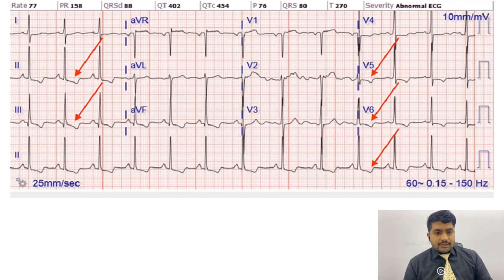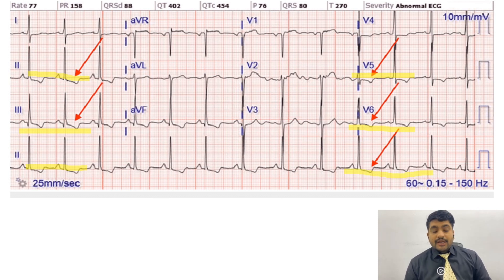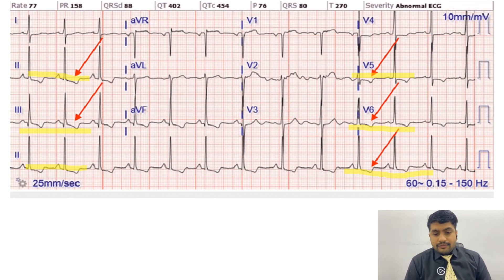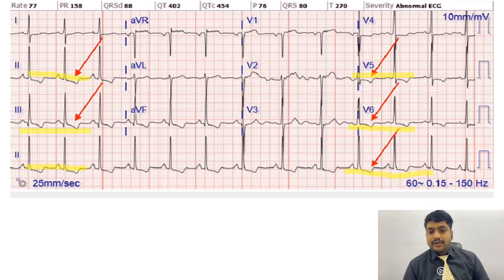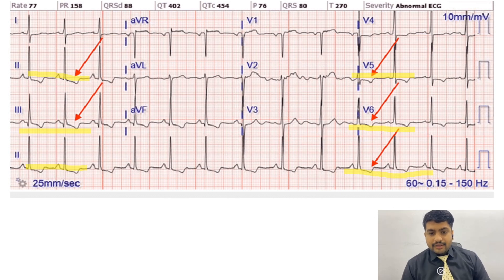In this ECG we have widespread T wave inversions across multiple leads. In the case of ST segment depression or T wave inversions, you should also look for a prominent R wave in that lead. If you go back and check all the ECGs just discussed, you will see that whenever there is ST segment depression, the R wave is more prominent than the S wave — meaning the ratio of R to S is greater than one. That is our prominent R wave.